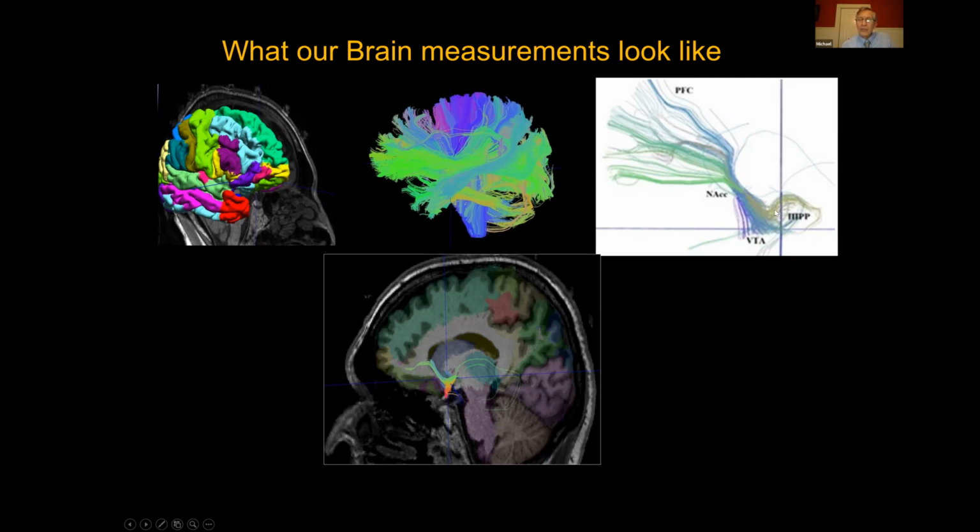We're using this to see whether these pathways are different between some of the tactical aviators we work with, people that fly the high performance planes. We can co-register these images with the neuroanatomical scans. I believe these are the dopaminergic projections out of the ventral tegmental area and substantia nigra, projecting up through the nucleus accumbens to the prefrontal cortex.